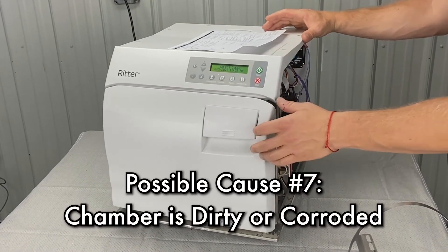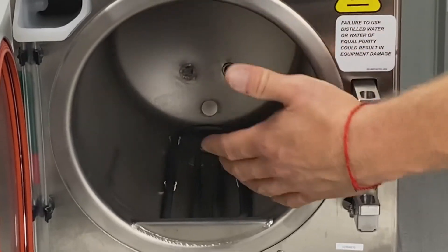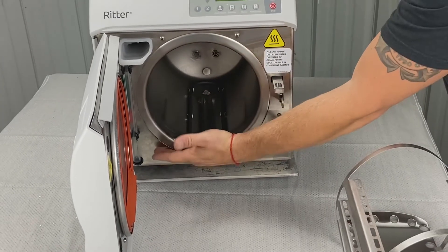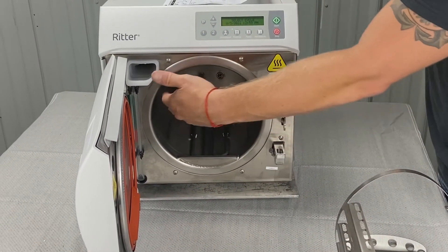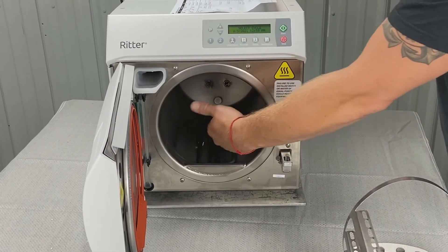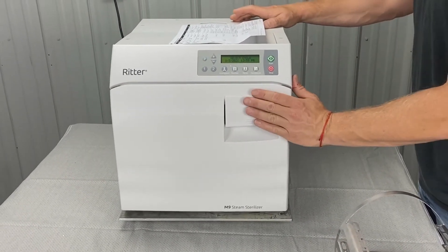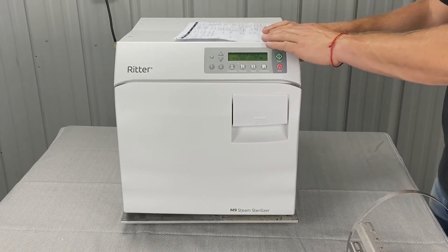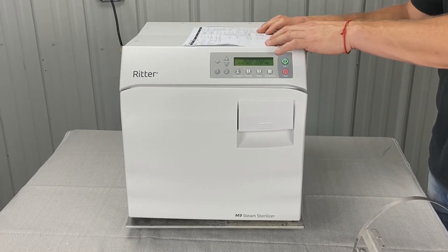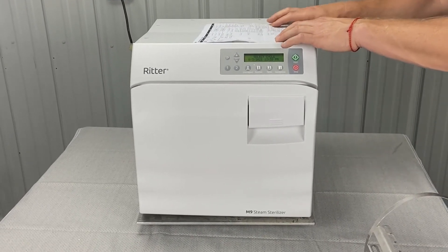A dirty or corroded chamber is another cause. If you're not draining the water and always adding water, you'll get a buildup of biofilm at the bottom of the reservoir that can work its way into the valves, causing fill issues, or get into the chamber and burn to the sidewalls and heating element — essentially cooking the instruments instead of sterilizing them. Inspect the bottom of the chamber and clean it with speed clean and distilled water that meets the water purity specifications in the user guide.